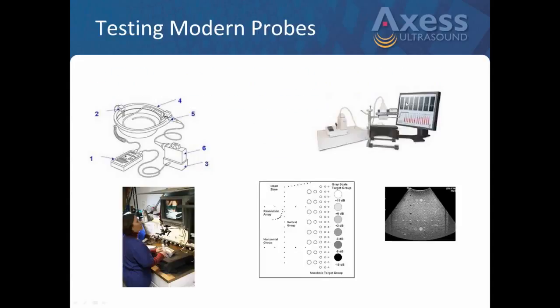Where you will see big problems with dead elements in Doppler, and there's a white paper out that was done, I believe, on a study in Sweden with ultrasound, is in cardiac phased array probes. If you have 2 or more adjacent elements dead, Doppler will give the indication that the patient has mitral regurgitation, which, if you know anything about the heart, is a terrible thing, and if a cardiologist sees that and didn't know any better, it could certainly lead to unnecessary surgeries and further tests. So there's a good white paper out about that.